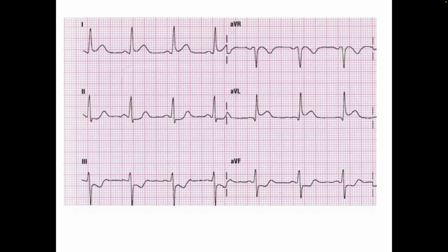Here, yeah, just barely 1, okay? And so, cath lab probably, and reciprocal changes, definitely, okay? Reciprocal changes are a great way if you're a little confused. Is that enough elevation? Oh, reciprocal changes, we're hoping.